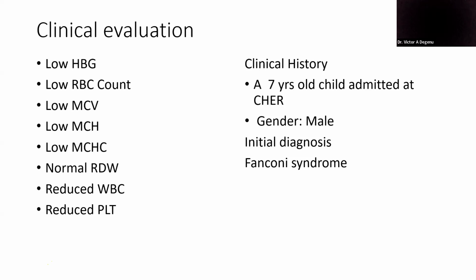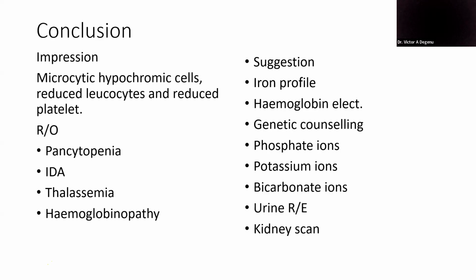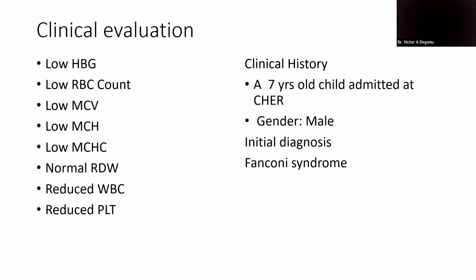All right. So, a quick summary of all that we did this evening. We looked at 4 different full blood count results produced from our machine, and for some of them we do not have any clinical information as to what is wrong with the patient. So we have to make that initial diagnosis for the clinician. So that was what we did.